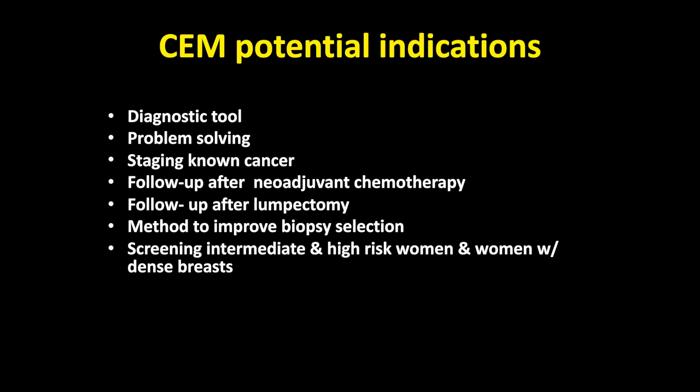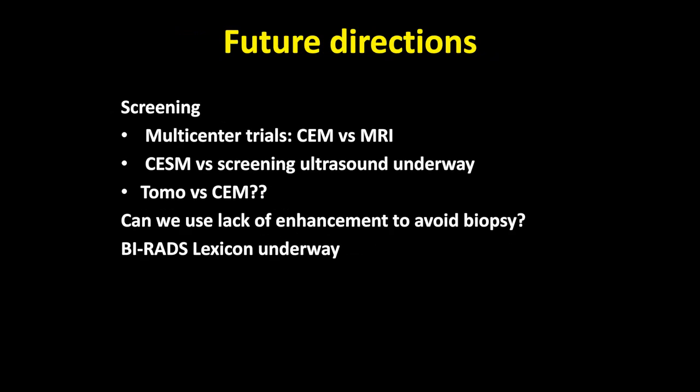Future directions include multi-center trials comparing contrast to MRI, and even more importantly, contrast mammography to tomo plus ultrasound. We also are going to further investigate the possibility of using the lack of enhancement in an otherwise benign appearing lesion to avoid biopsy. And we are trying to develop, and I shouldn't use the term BI-RADS, but we're trying to develop a lexicon so that everybody uses the same language, just as we do with BI-RADS.